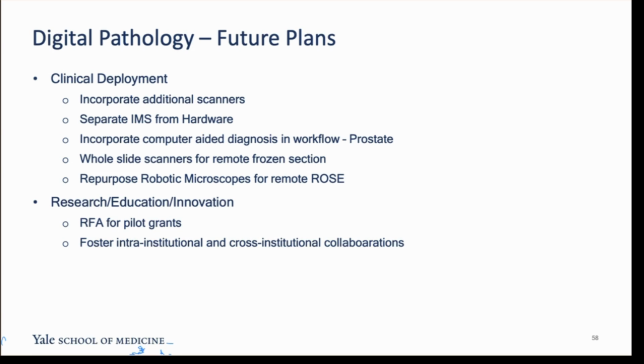But I think these tools will keep on increasing, regardless of FDA approval or not. When we talk to institutions that have deployed these, it's interesting: the sensitivity seems to be high, but some of the other metrics, not quite so much.